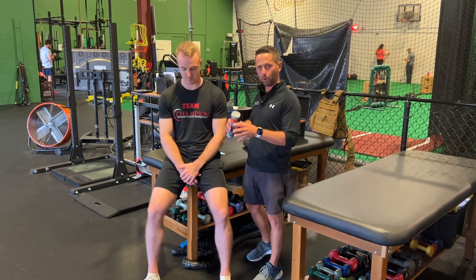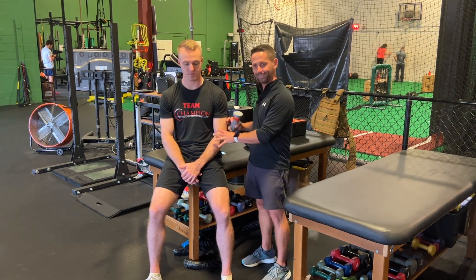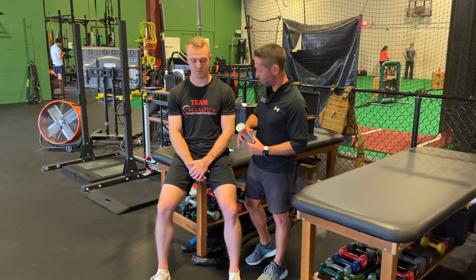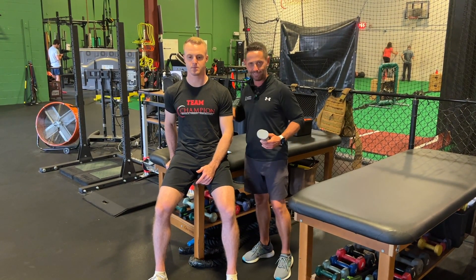The first thing we're going to do is make sure we're positioning them to take out as much movement of the body as we can. I want to isolate the shoulder as much as possible. So we sit on the corner of the table, feet flat on the ground, on a nice stable surface. We're going to start with the left arm, so I'm going to have him take his right hand and hold onto the table so we are nice and secure.